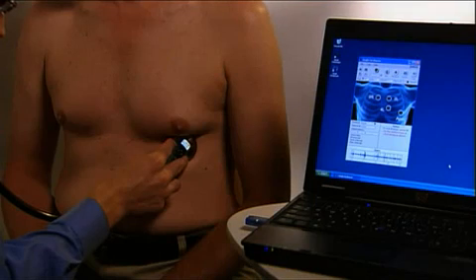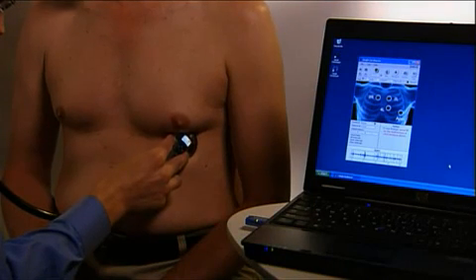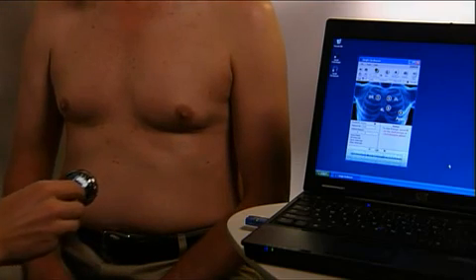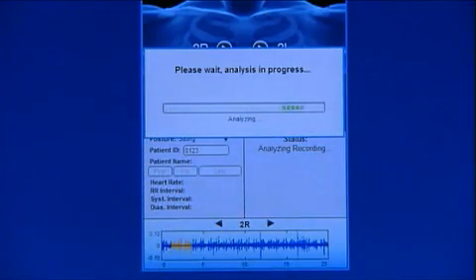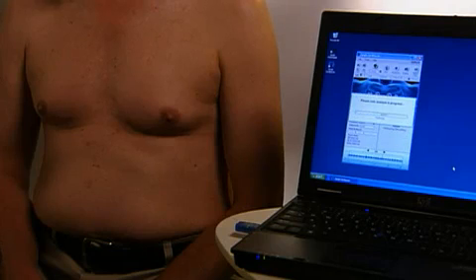Follow the Zargis CardioScan software voice prompts heard from the ear tips of the Littmann Model 3200 stethoscope. After the four recordings are complete, press the M button on the Littmann Model 3200 stethoscope, or the Analyze button on the top right of the Zargis CardioScan software. The Zargis CardioScan software analysis algorithm will then take approximately one minute to compute, depending upon the processing power of the PC, and produce the analysis results.